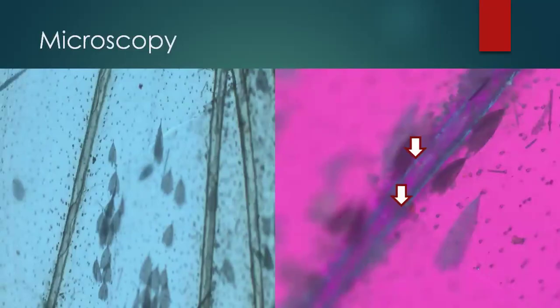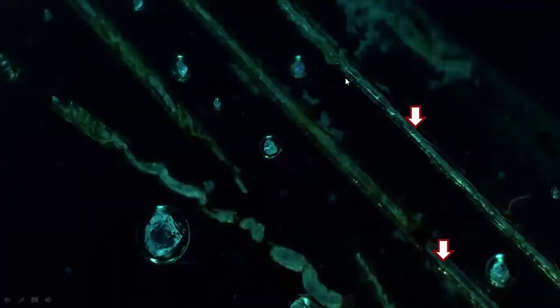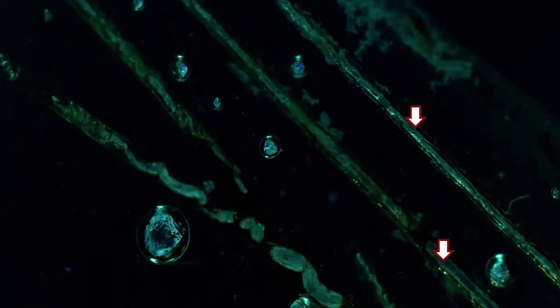When I see the wings, I see characteristic hyper-reflective areas on the edges. And when I stain them, I found these are the chitin layers. These are the chitin layers of the wings. Chitin layers are found in the hair. Chitin is not found in humans. It is found in parasites, this type of moth and other things, and also in fungus.